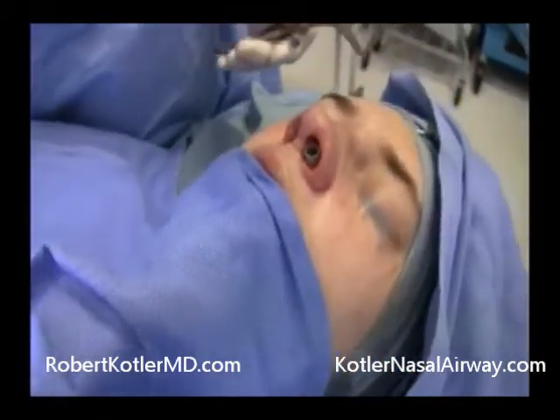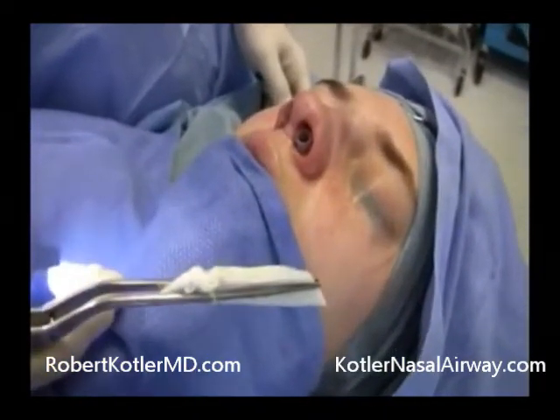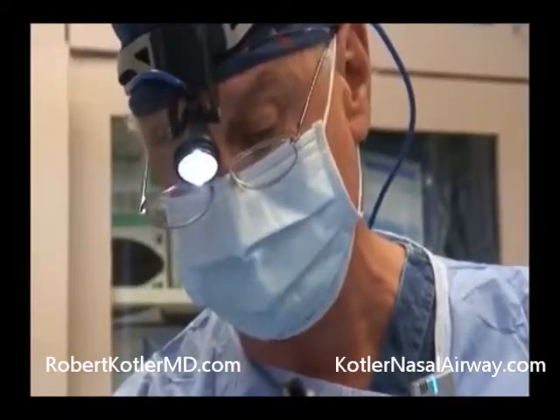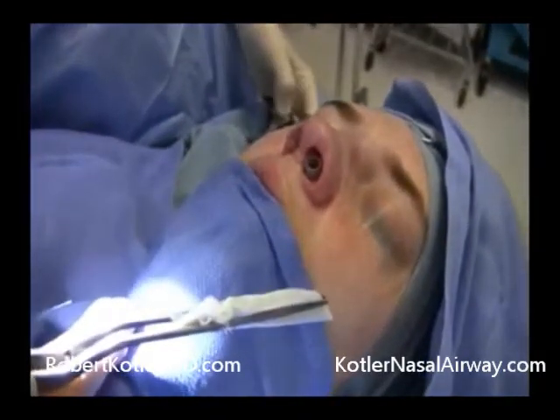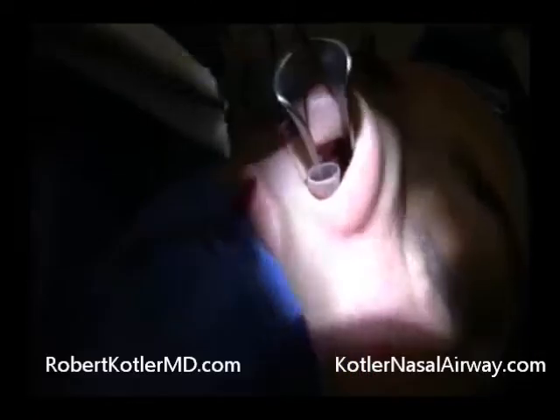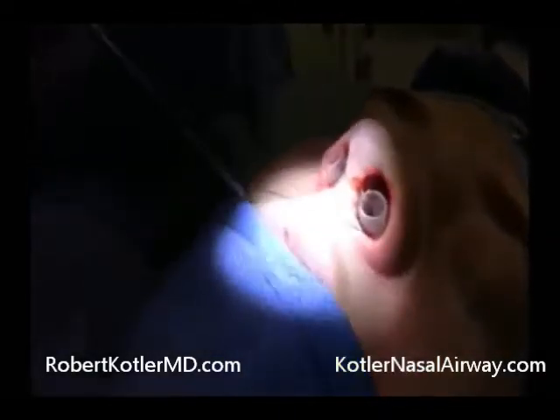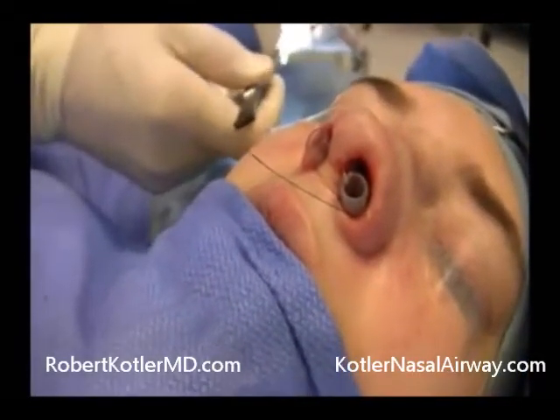Now I'm going to insert the packing. We use a Telfa pad folded in 2, coated with Achromycin ointment. You notice a 4-0 nylon suture is placed, and that's to prevent any chance of the packing slipping into the nasopharynx. And I'll insert this. Now I'm inserting the packing. Again, I'm making sure the tube is still on the floor of the nose. There's plenty of room. Sits right there. Done. Okay? Now I'll put the packing onto the other side.